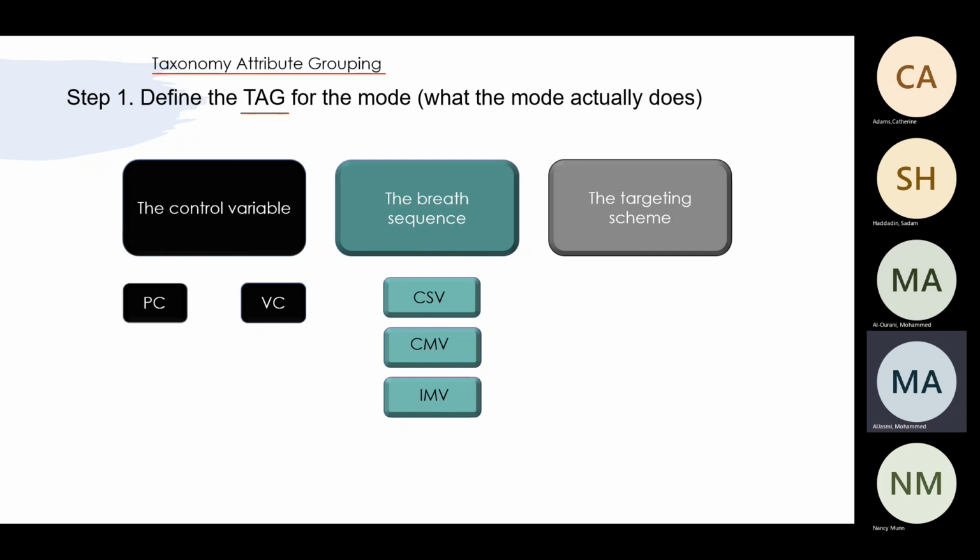There's another side. The machine will not give you any breath if the patient does it spontaneously. Let's say I put the machine on 14 breaths per minute, but the patient is breathing 16 by himself. There's no support for those breaths the patient does by himself. After a few hours, the patient has an event and goes down to 10. So 10 will be by the patient, and the remaining 4 will be by the machine.